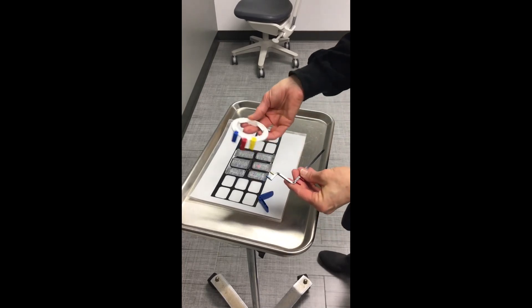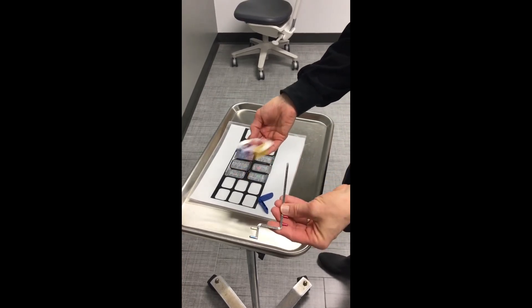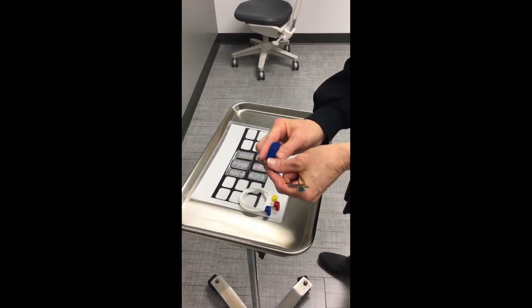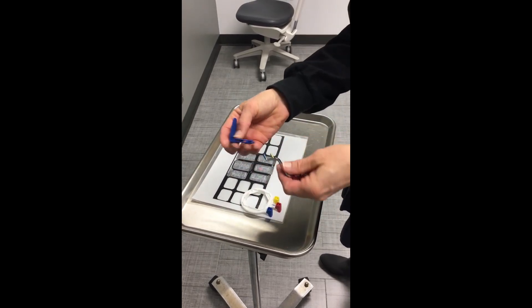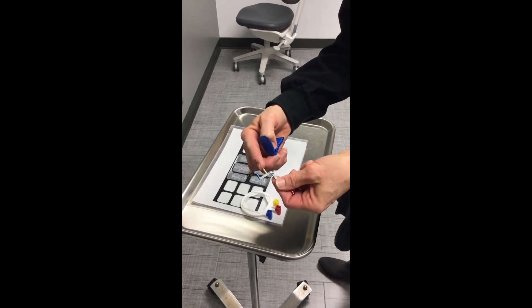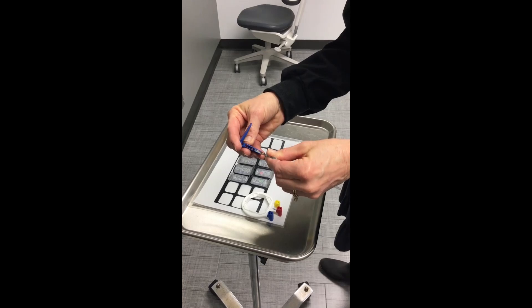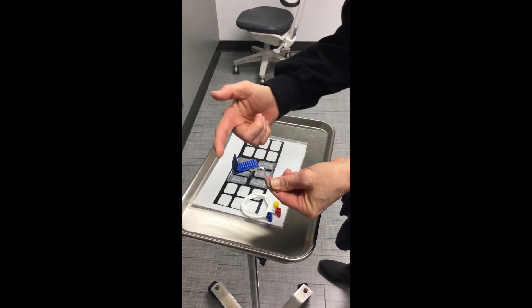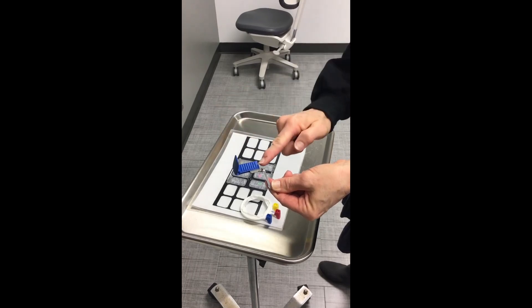You have three parts to your instrument: your ring, your arm, and your bite block. Start by taking your bite block and placing it on the prongs — the blue and yellow — placing it in the bite block as far out or away from the front as you can.